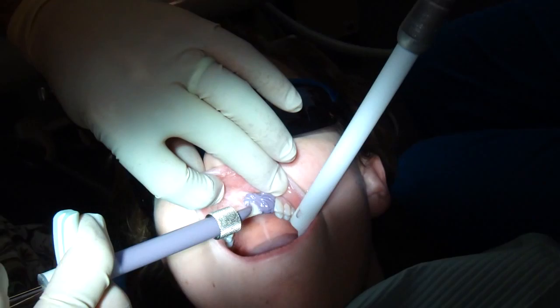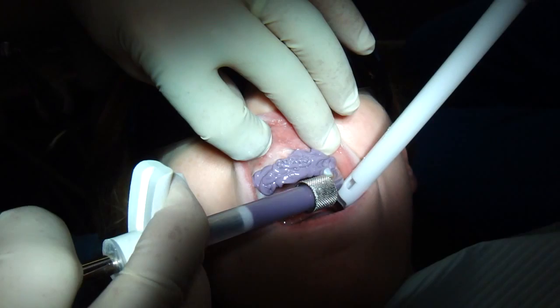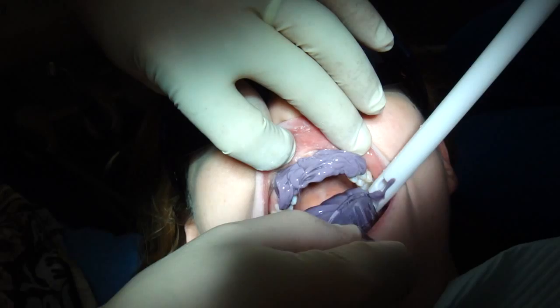All right, this just gets a mold of your teeth, because we're going to make these porcelain veneers in a dental laboratory, and they'll actually take this. This will turn into a hard rubber. They will take it, pour it up in stone, and they'll make the veneers on a model, and then we'll bond them in about two weeks from now.